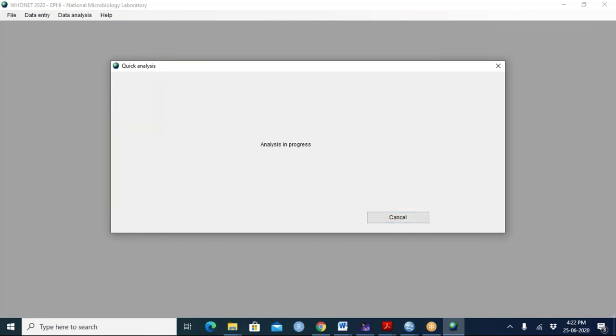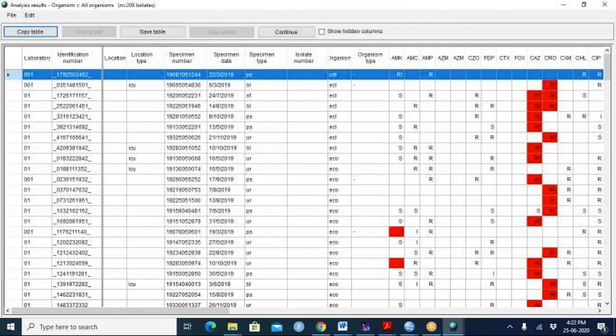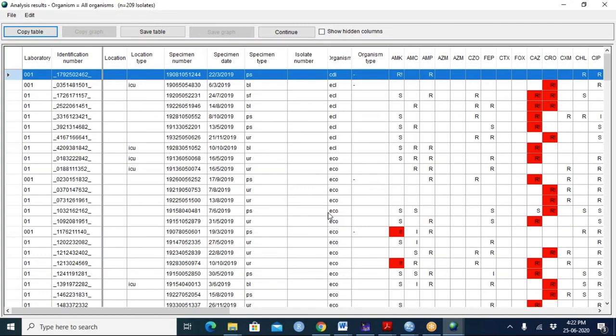We're running short on time. Normally I'd show you how to export this to Excel, but it's easy, you just choose Excel. So this is a list of bacteria that have either an important species alert or an important resistance alert. At the top of the screen, you see there were 209 isolates.